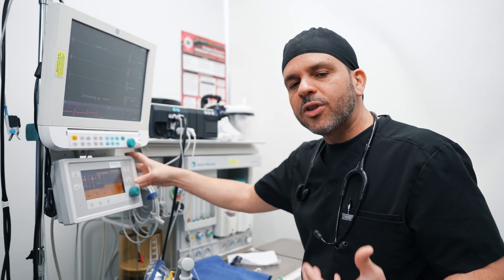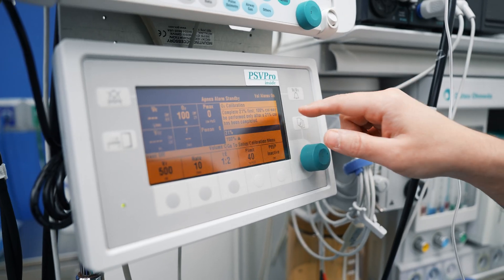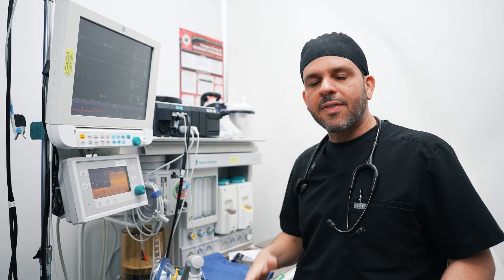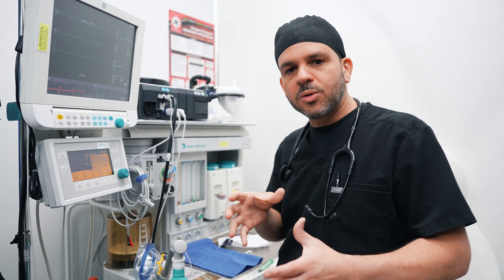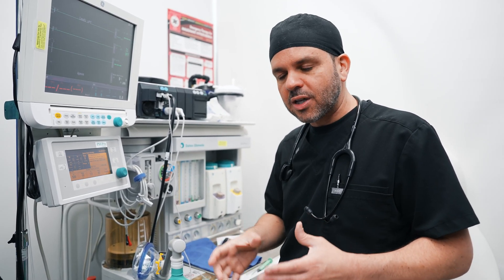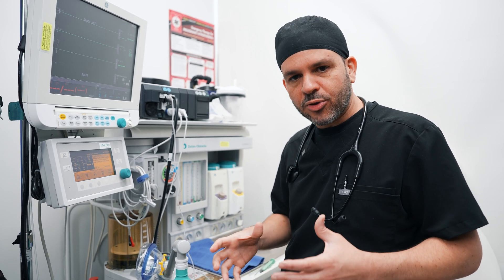Now I'm going to do what is called a machine check. I'm going to calibrate the oxygen to 21% and then calibrate it at 100% oxygen, so it's well able to give me adequate measures of how much oxygen you're getting throughout the whole procedure.